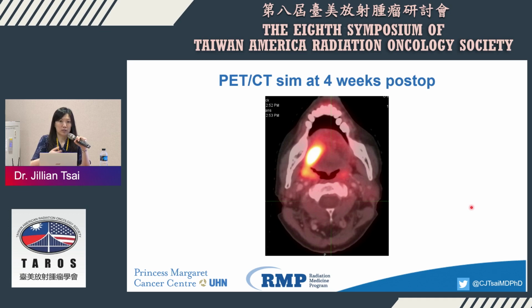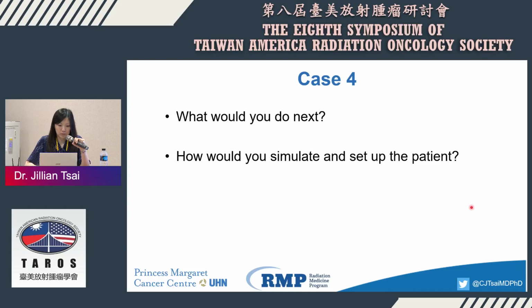The post-operative changes on the PET tend to be diffuse, not particularly bright, coupled with exam, unless the patient had infection or abscess that would make you suspicious. Therefore, if we see something very suspicious, we typically biopsy that just to establish diagnosis. Okay, so that's what we did, and there was no tumor. It is post-operative changes, so we would proceed with the setup and simulation.